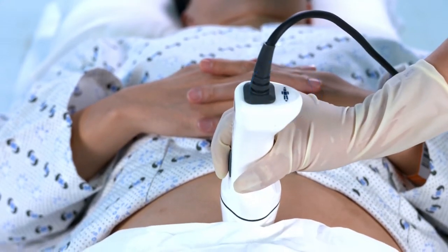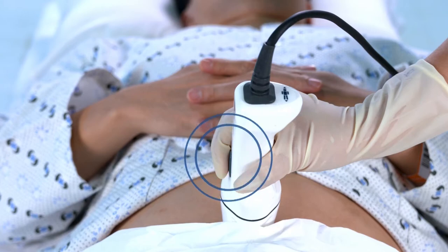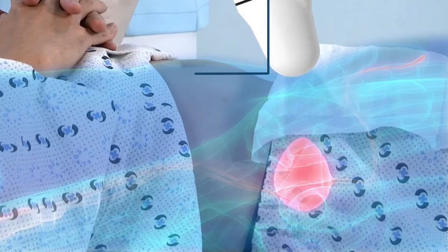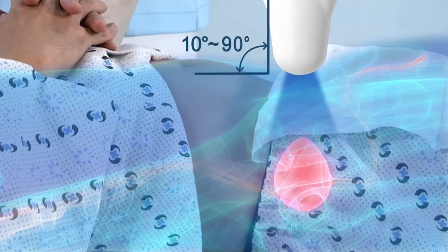Press the scan button on the probe or touch the scan icon on the pre-scan screen. Place the probe from the target location towards the bladder and slowly raise up until you find the biggest area of the bladder.